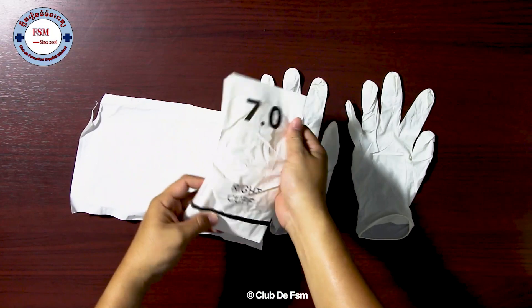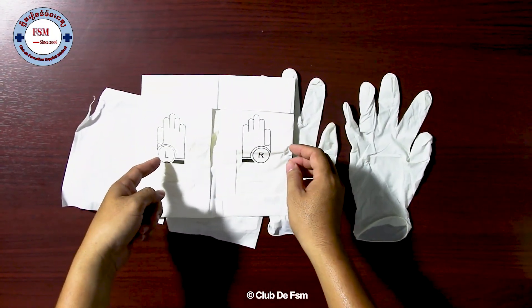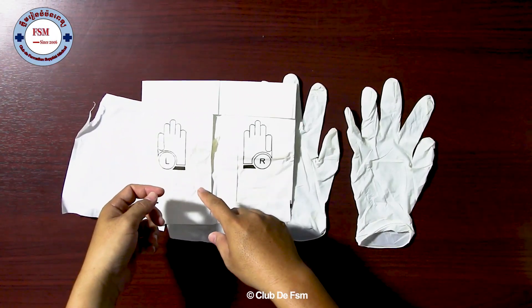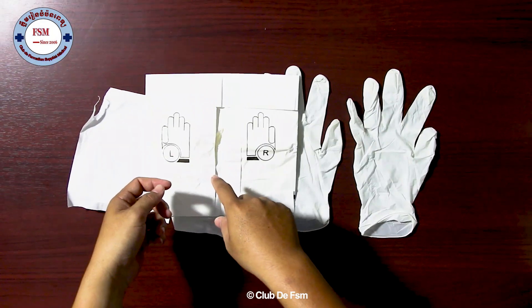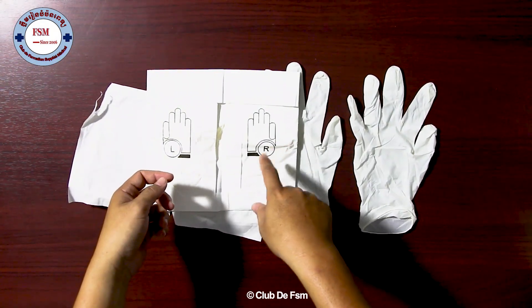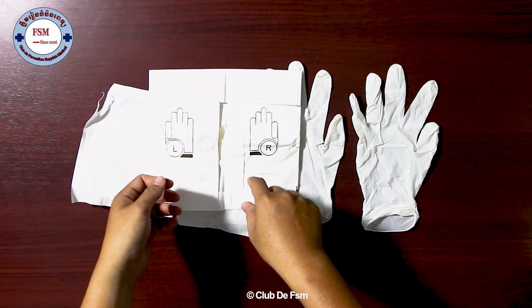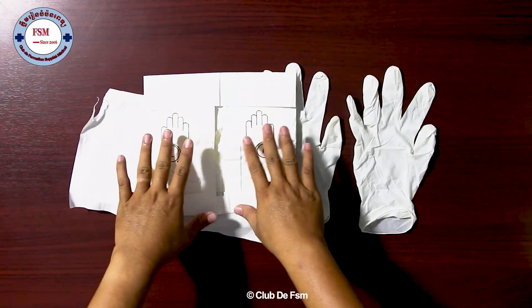When we put this, we know that it's left hand and right hand. The first one we can give to the surgeon. Some surgeons prefer left hand first, and some surgeons prefer right hand first. But for me, I prefer left hand first. And this is sterile.